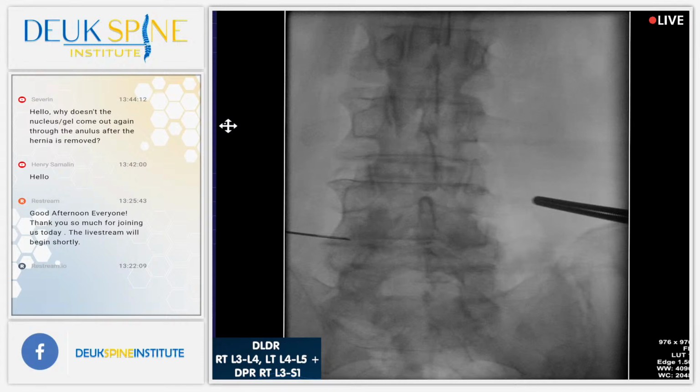Pretty good. All right, let's get started with 3. I'll take a needle. All right, so for those of you who don't know what we're doing, we're actually treating his facets. You have any num-num? I'm going to put the needle down right here. Let me have the num-num. Thanks. I'm going to need more light on, please. Thank you. And an 18 gauge, please. Thank you.